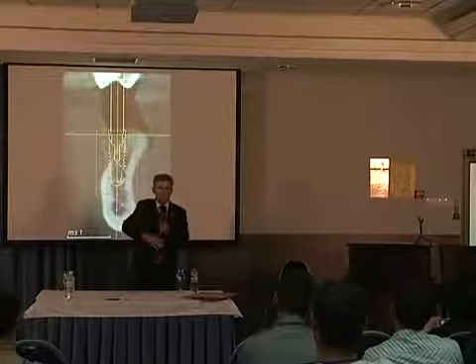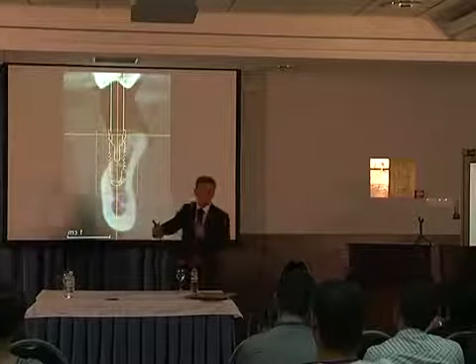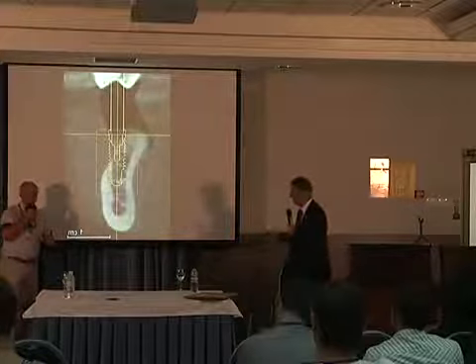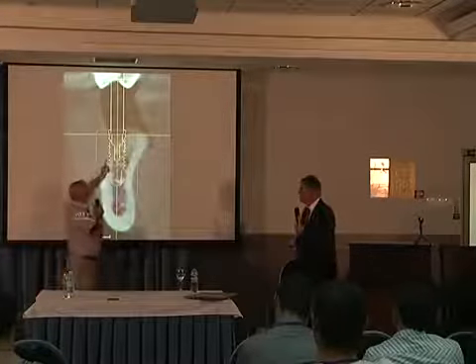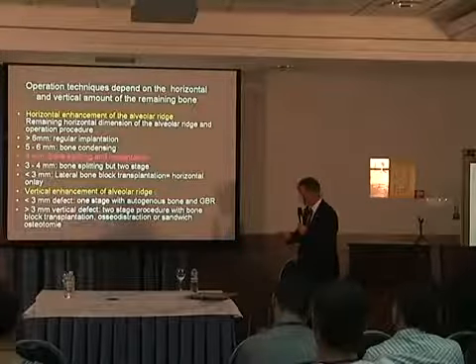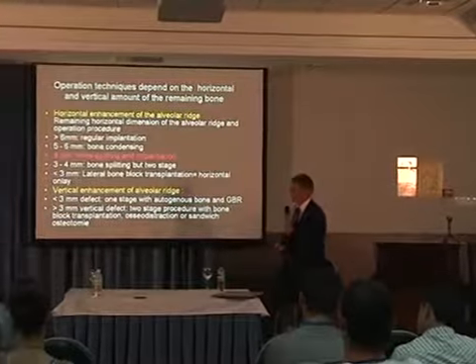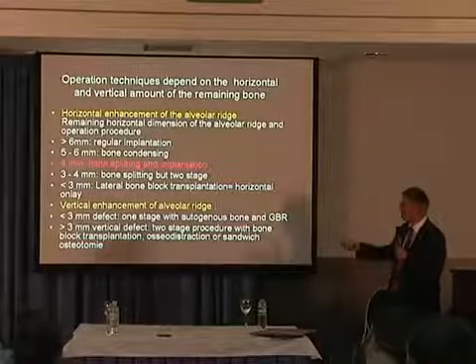Soft tissue shrinkage, aesthetic disaster, nightmare, long pocket, implant loss in the future. Можно предусматривать, что получить здесь какую-то определенную остеоинтеграцию, потому что кость здесь, кость здесь. Вот эта часть вестибулярной кортикальной пластинки, она будет открыта, резьба будет открыта. Мягкие ткани, если мы положим, там будет дефект эстетического характера, или просвечиваться будет, или будут какие-то проблемы, связанные с эстетикой.